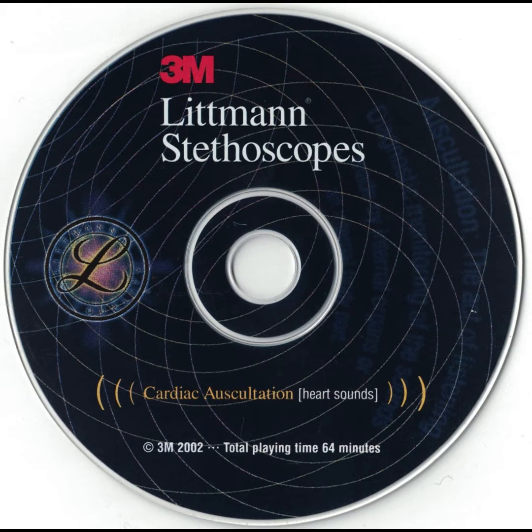Fourth heart sound. The fourth heart sound is a low-frequency sound heard just before the first heart sound, usually preceding this sound by a longer interval than that separating the two components of the normal first sound. It has also been known as an atrial gallop, a presystolic gallop, and an S4 gallop. It is most commonly known as an S4.